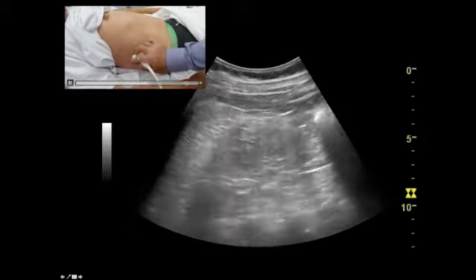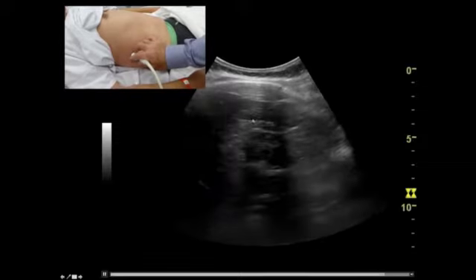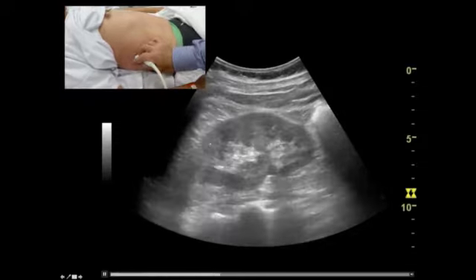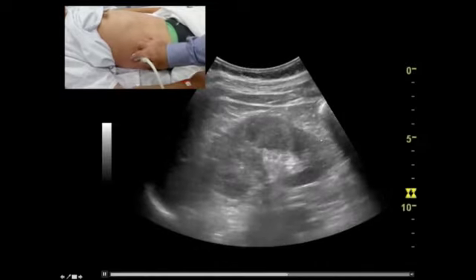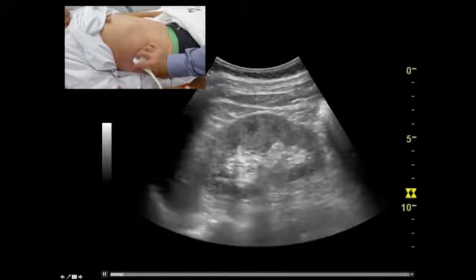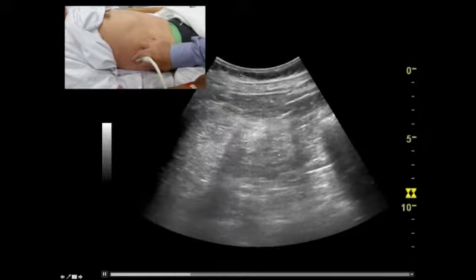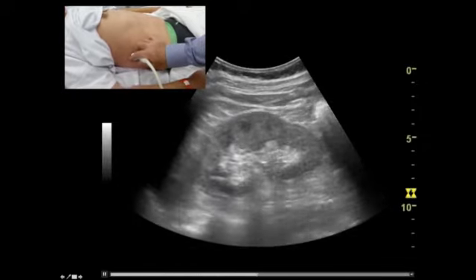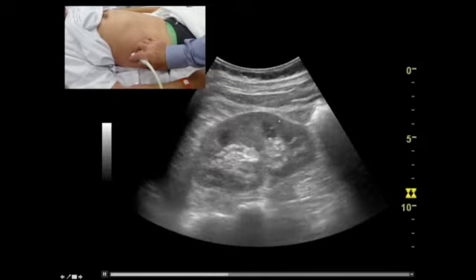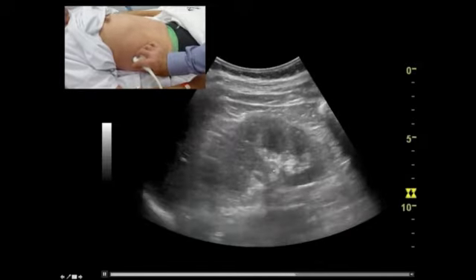And here you can see that the kidney is actually closer to the probe because we're looking from around the back. You're getting a beautiful view, no ribs in the way, and this guy happens to have a very good acoustic window here. And you're seeing the lower pole nicely, which you weren't seeing from the front before. You're also not being obscured by ribs. So this is probably the acoustic window of choice in this gentleman. And you can see here the nice little hypoechoic medullary pyramids there. You can see the renal cortex, and you can see the echogenic collecting system.